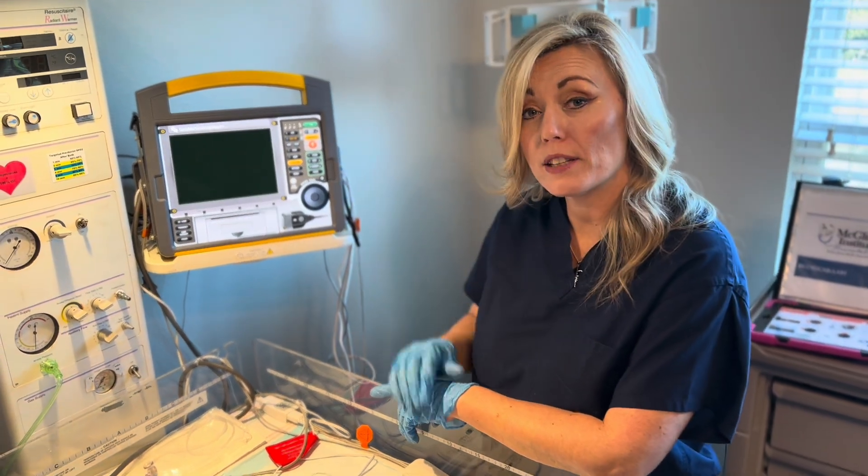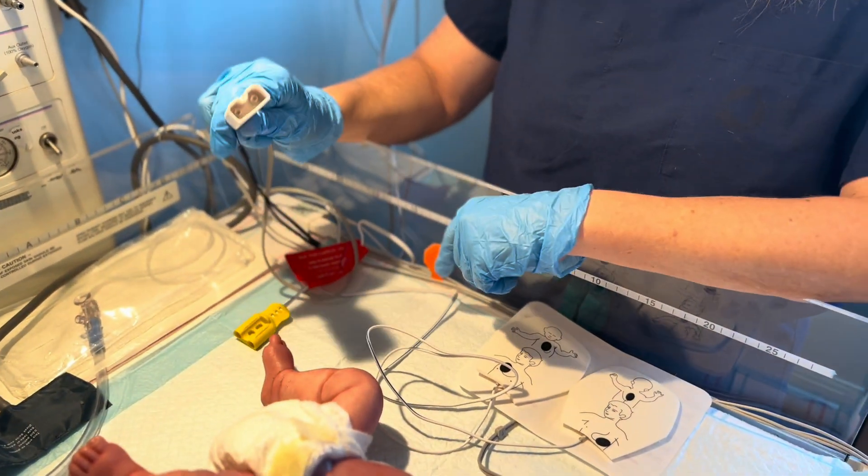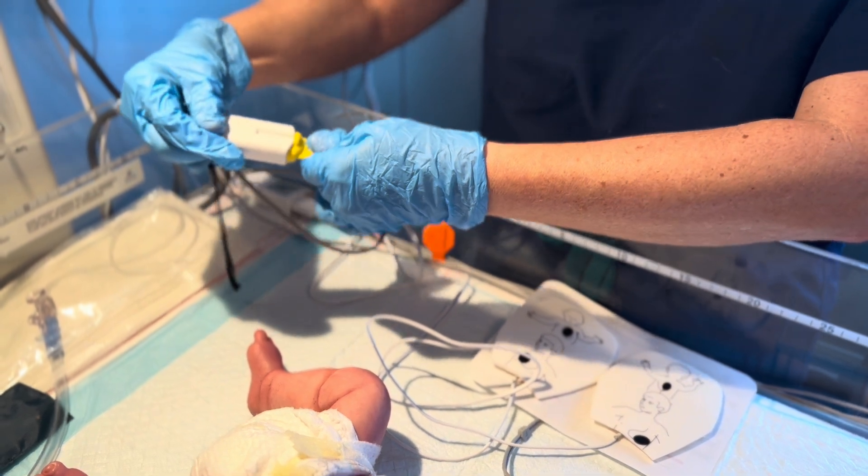Once your defibrillator arrives at the bedside, it's time to apply your quick combo pads. First, you need to take your quick combo connector and the quick combo pad connector and place them together, as seen here.